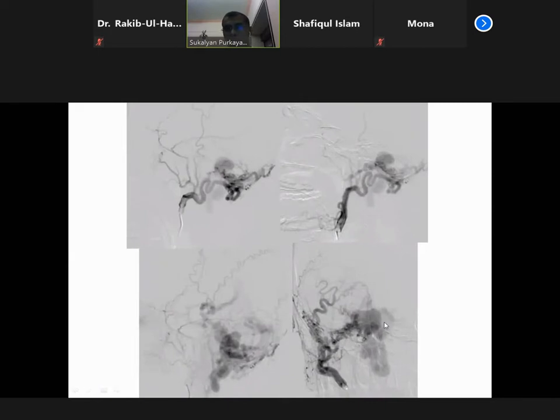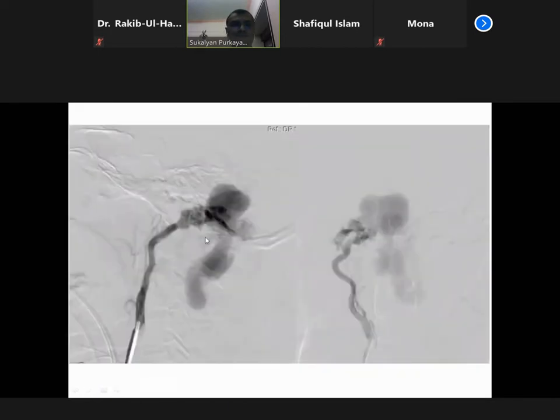Okay, so again, this is the ascending pharyngeal artery. Now you can see that this is the anterior branch which goes to the pharynx. This is the posterior branch which goes and directly supplies this large sac. So this area is the microfistulae, and this is the vein which appears first. So what we have to do is block this area only, and that's a cure.